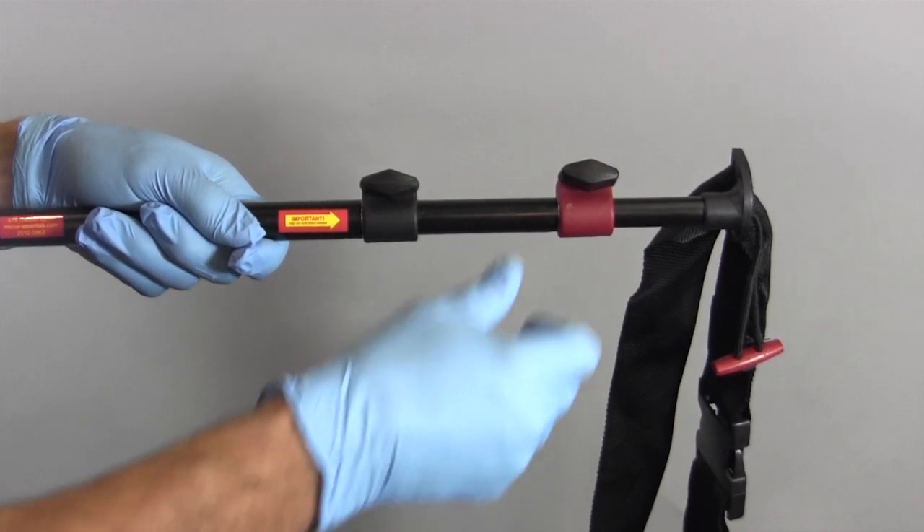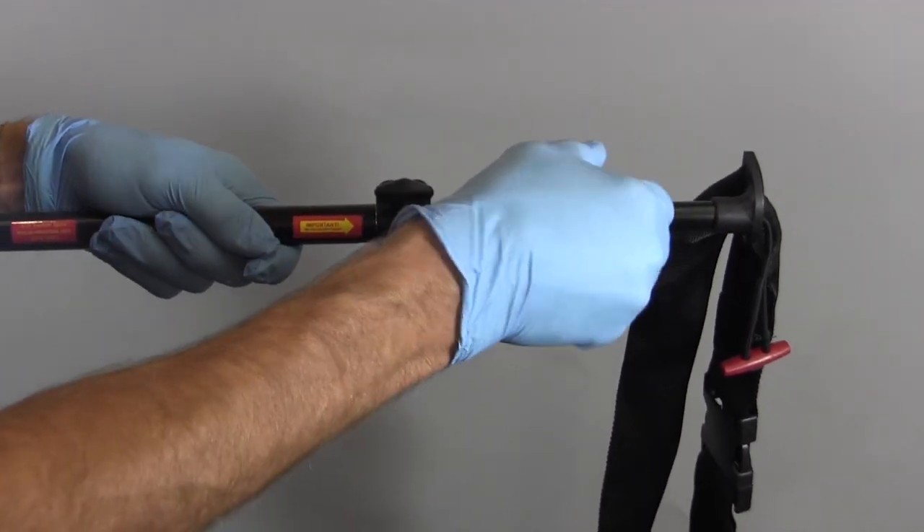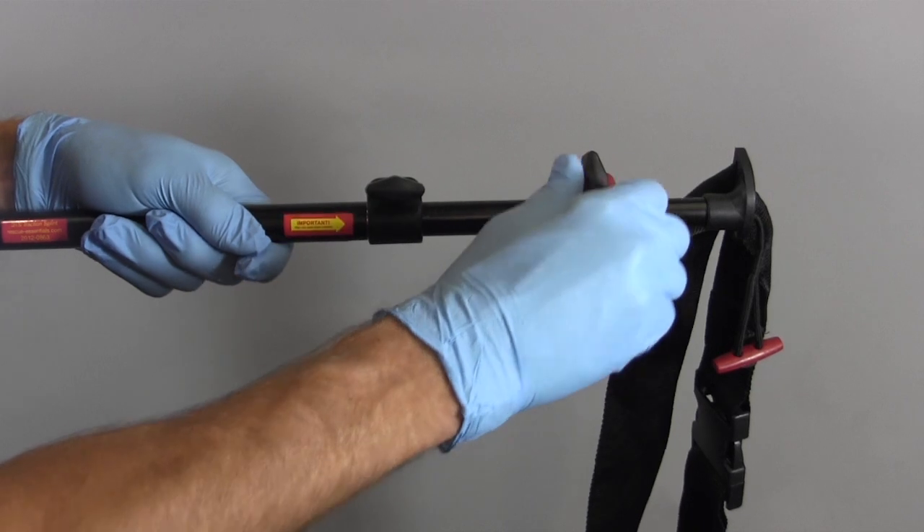The traction splint now uses thumb screws for easy adjustment. Simply loosen or tighten the thumb screws to the desired setting.